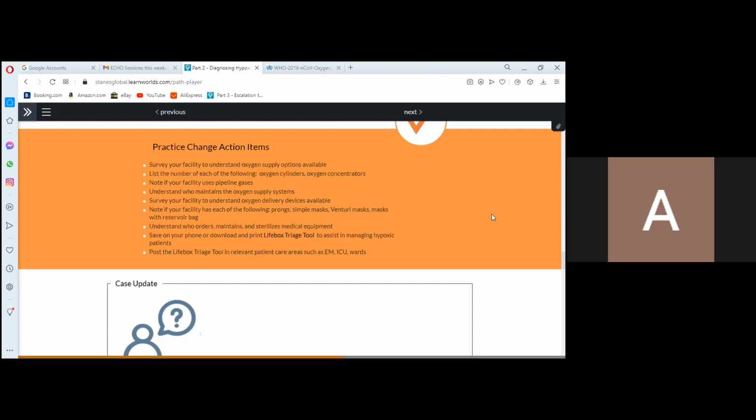There is a way you maintain all these oxygen cylinders for safety and so on. You have the risk of fire and explosion. For example, I remember well, the regulator, you cannot use oil. You will see that it says use no oil and things like that. So you should be very careful. You have protocols to deal with that.